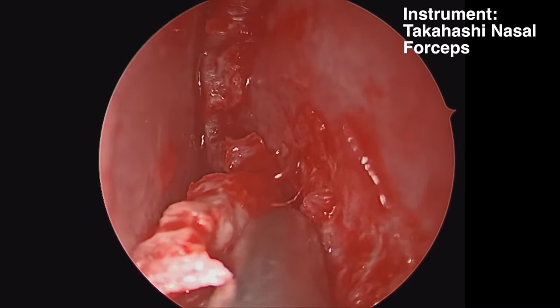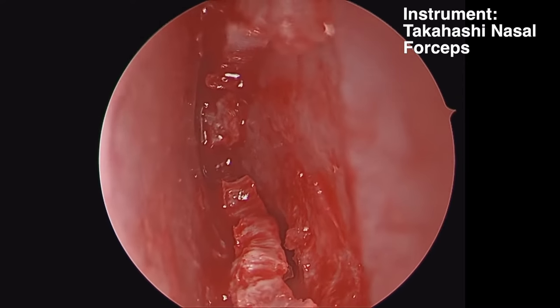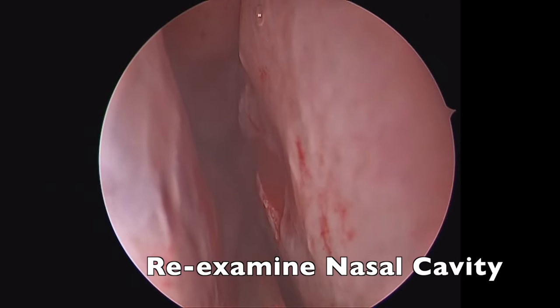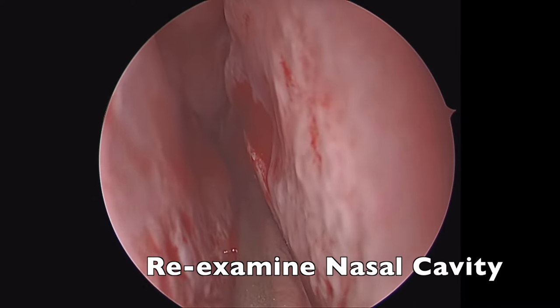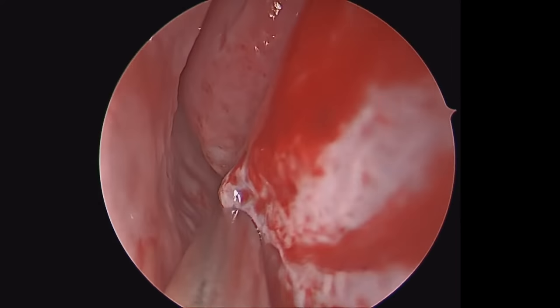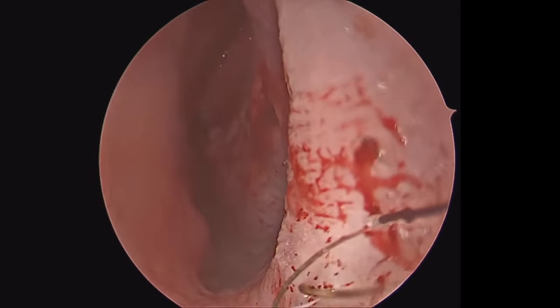Here we're freeing up more of the cartilage, and then we start to see the bony-cartilaginous junction right there. We'll use the Takahashi to remove this portion of the cartilage, turning carefully. We're looking at our flap to assess if we've removed the deviated portion. It appears there is a small rent in the mucosa from removing part of the bony spur, but the opposite side has no tear, so it's very unlikely we'll get a septal perforation as long as the opposite side is intact.